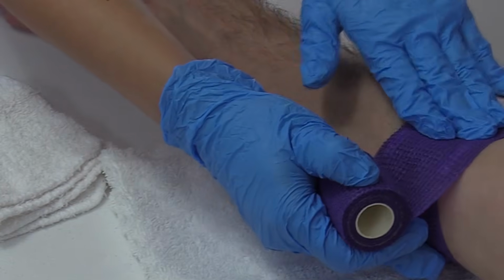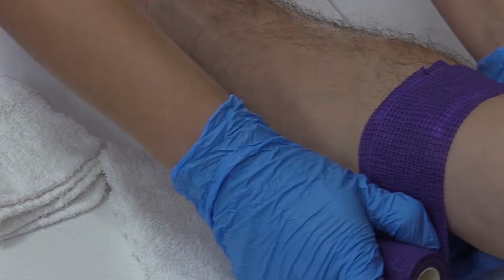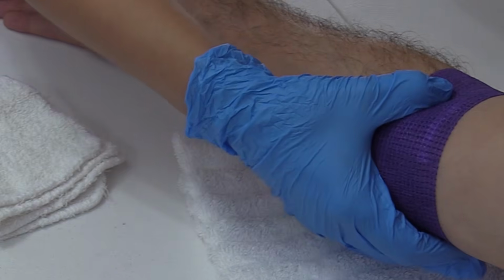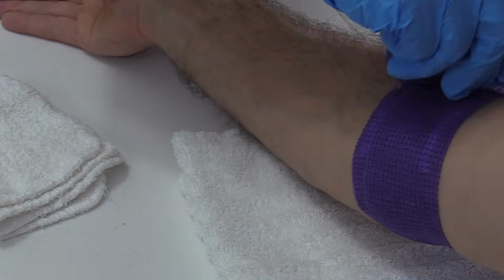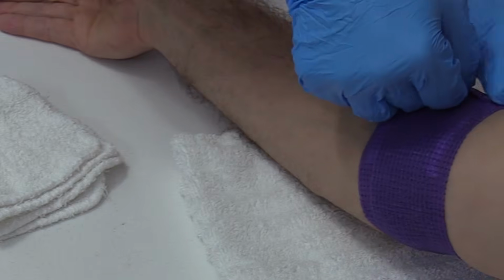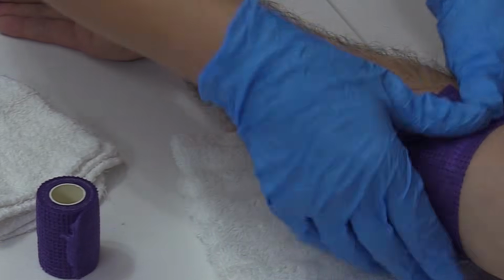I'm going to apply pressure right here. And then I'm just going to go around just one more time, and I'm not putting it too tight, just tight enough to apply pressure. Okay, and that's good, and I'm going to tear it off. You can tear it or cut it, it's whatever you prefer. And then I'm just going to give it a little squeeze, make sure it sticks to itself very nicely.